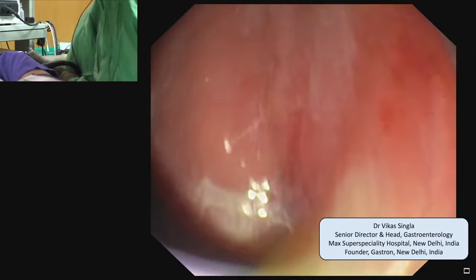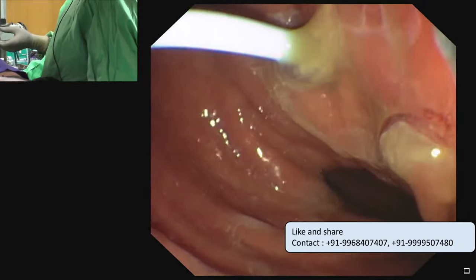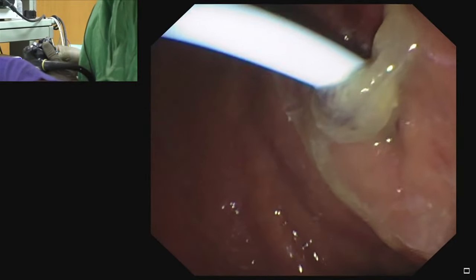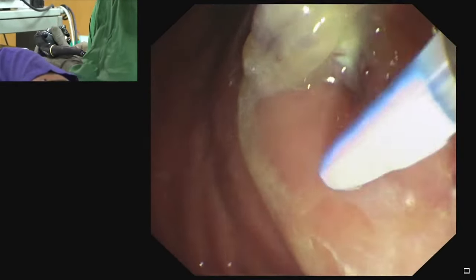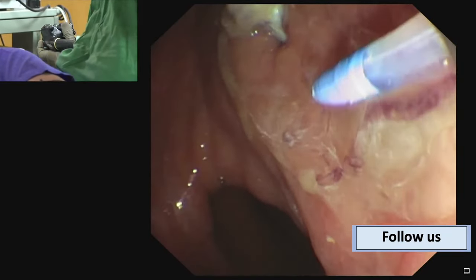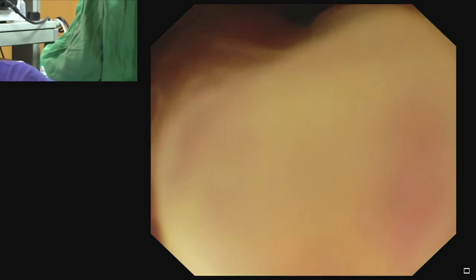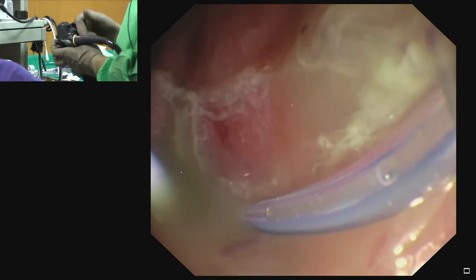We try to go above the previously placed stent. Using the elevator and the left dial on the side-view endoscope, we are able to enter the fluid collection. As soon as the cannula enters the fluid collection, a gush of fluid is seen, confirming the cannula has gone in the right direction.